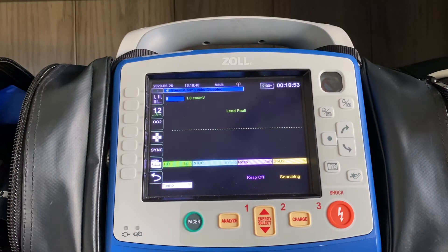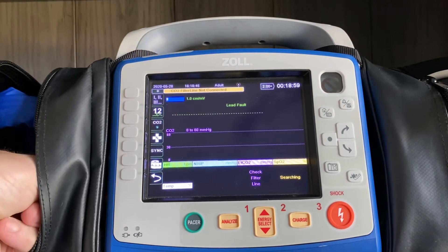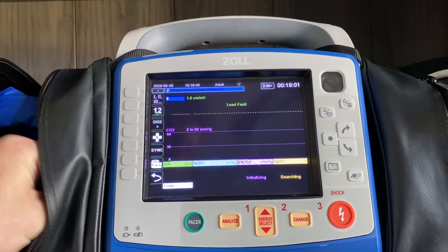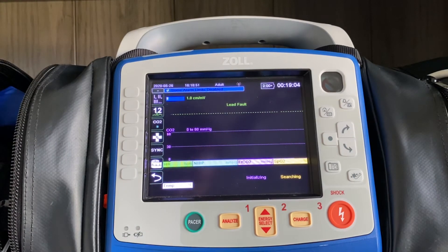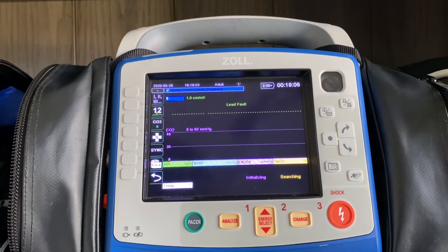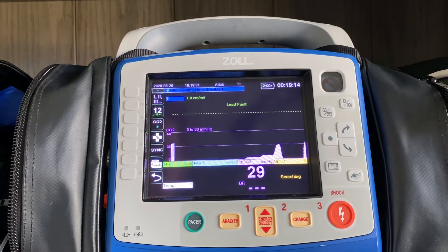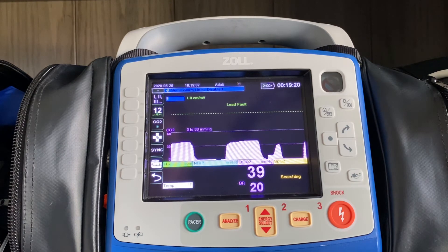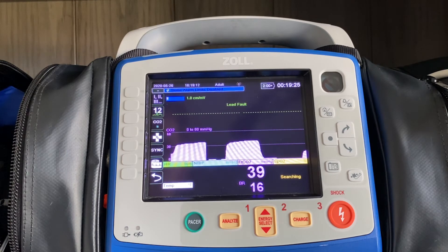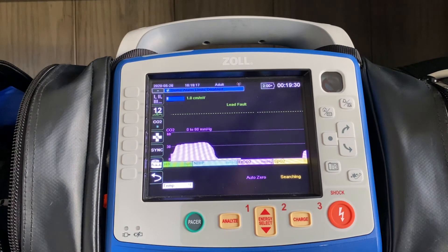The process is exactly the same. You hit the CO2 button, plug in your disposable piece, and take a couple of breaths. Those nice, flat, plateaued waveforms are what we're shooting for.